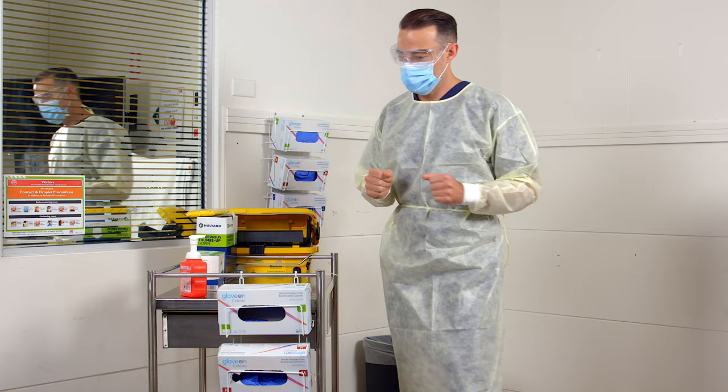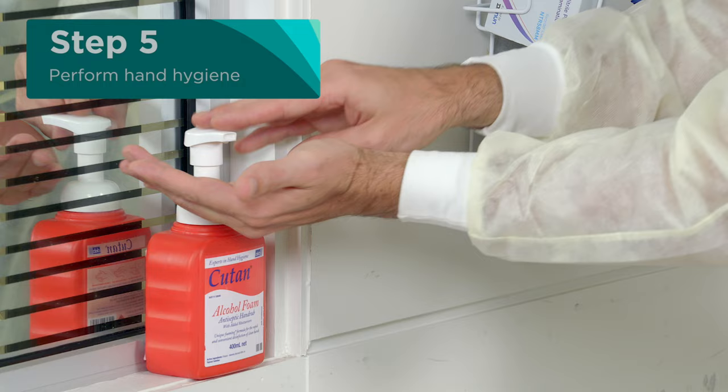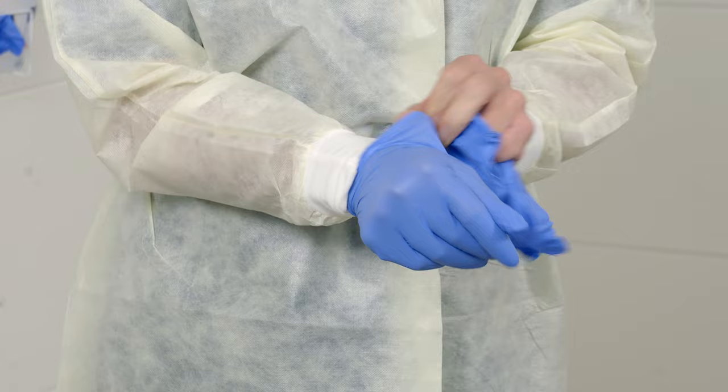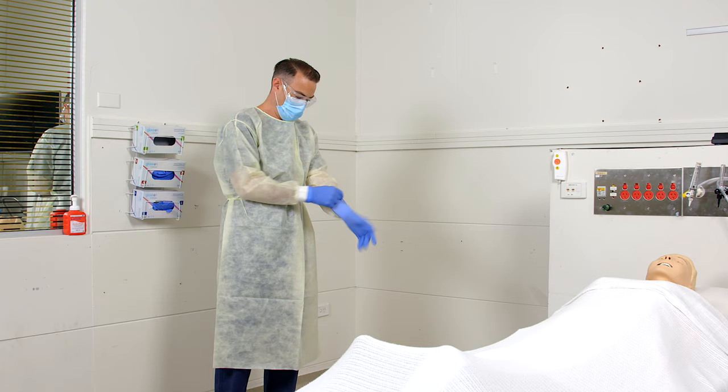Now you are ready to enter the patient's zone. Before touching the patient, perform hand hygiene. Then put on gloves. If you are wearing a gown with sleeves, make sure the gloves cover the cuffs of your sleeves.